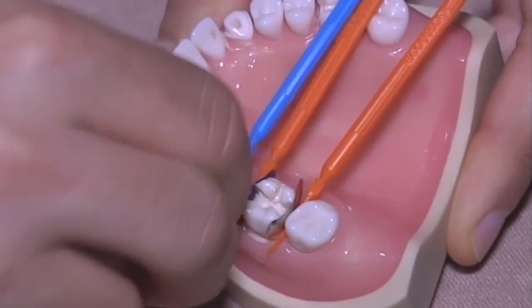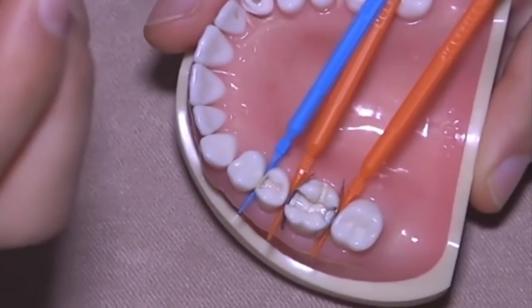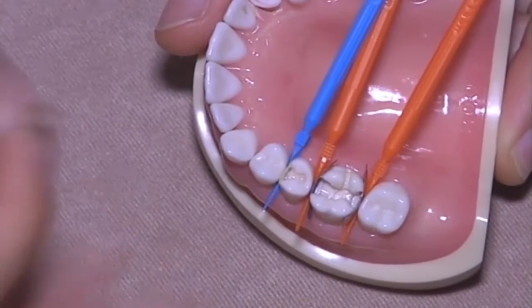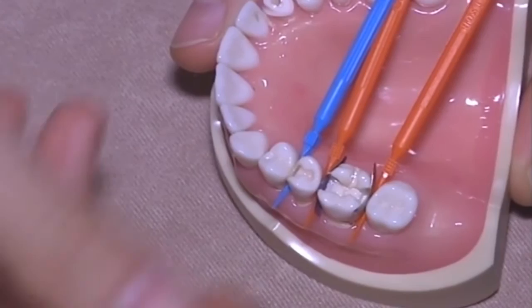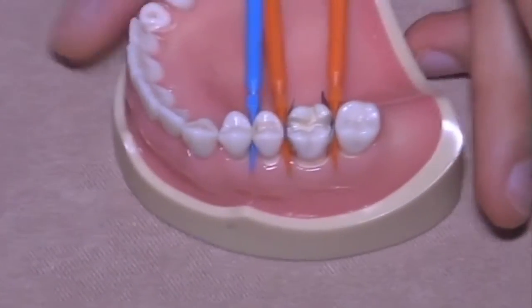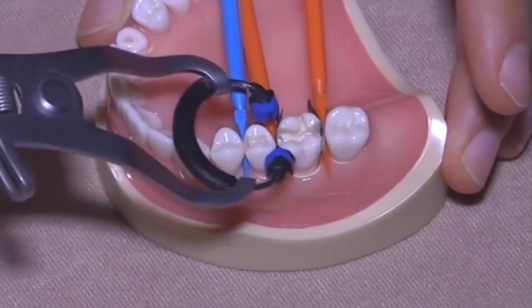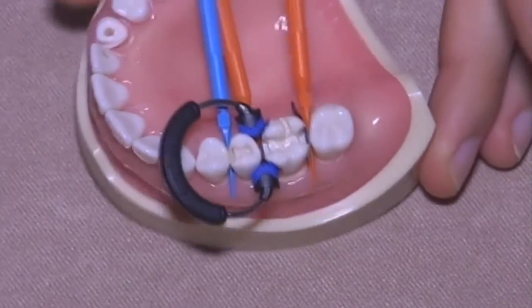I just suggest removing the matrix without removing the wedge. Why? Usually bleeding. Yes, if you have interproximal caries, you surely have inflamed gingiva. So let's leave it there, and we can immediately move to perform the other two.